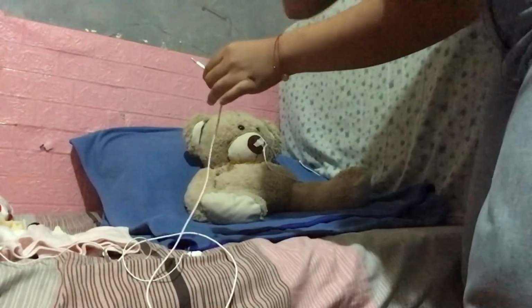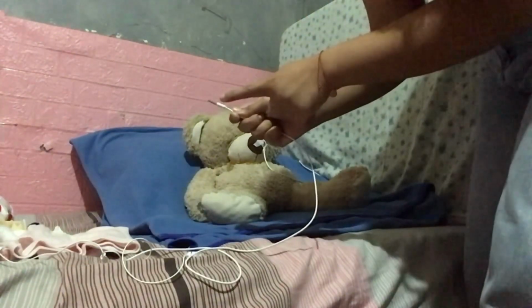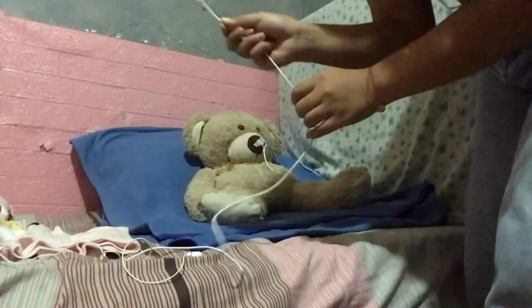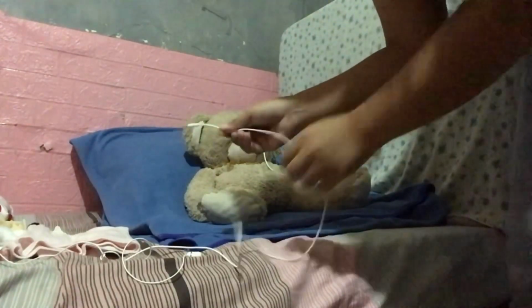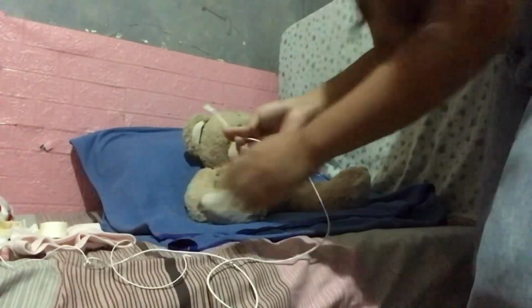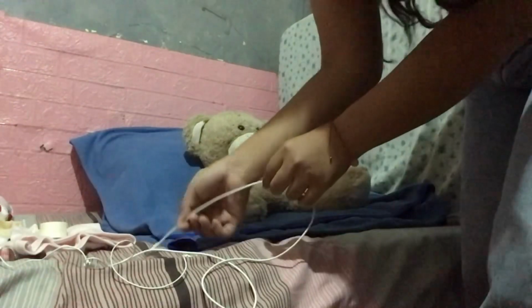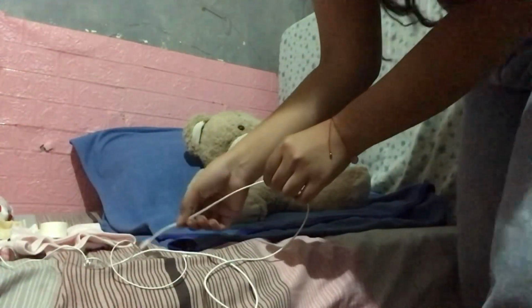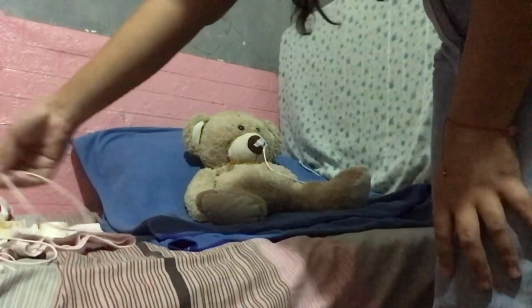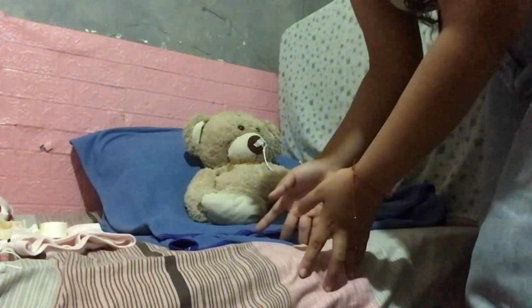So we have to lubricate the tip of the catheter. So without touching the tip of the catheter, you can apply a water-soluble lubricant generously to the tip and the first few inches of the catheter. So just imagine this is the tip of the catheter. So just imagine there is a water-soluble lubricant here. You just have to apply. That's it. Okay, so just imagine that is done. So now we have to proceed to clean the genital area.